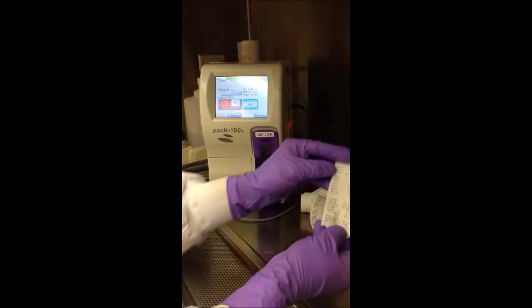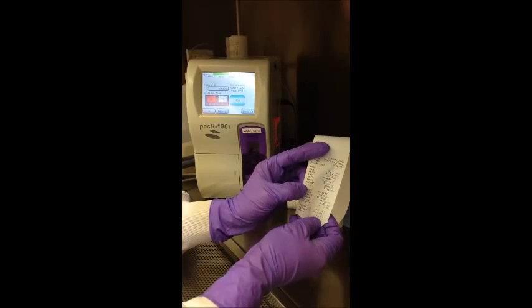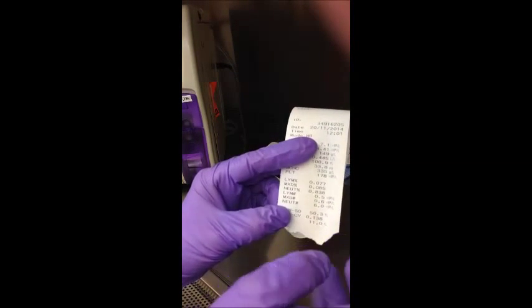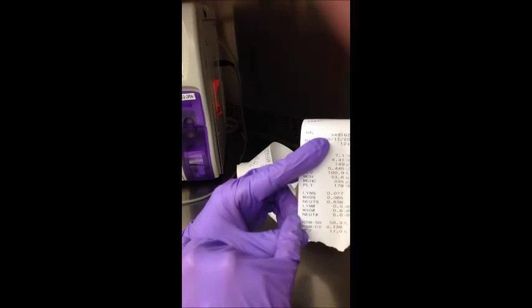So the first parameters are part of the CBC: the WBC, the RBC, the hemoglobin, hematocrit, MCV, MCH, MCHC, and platelet, and the differential portion, lymphocyte percent. MXD percent represents a mixture of basophils, monocytes, and eosinophils, and a neutrophil percent, and the correlating absolute values.